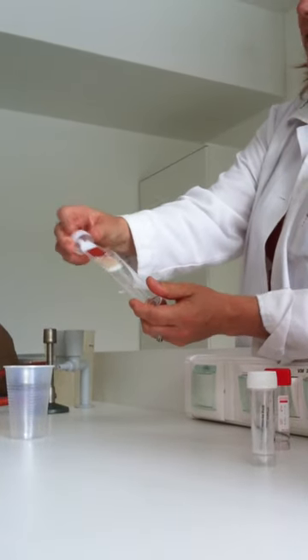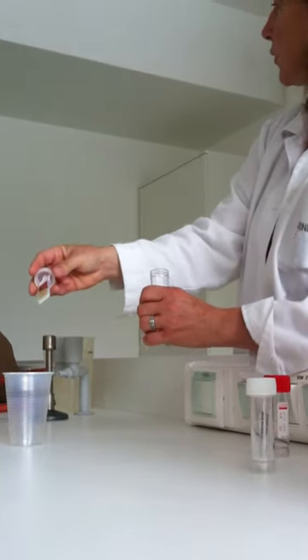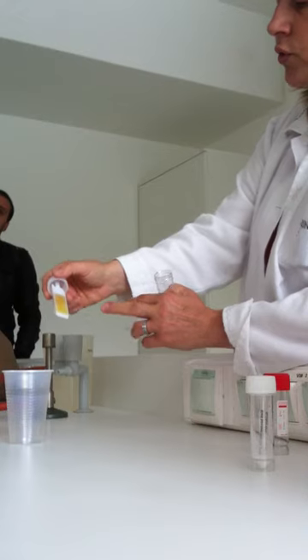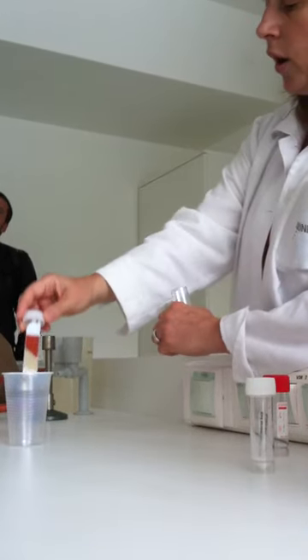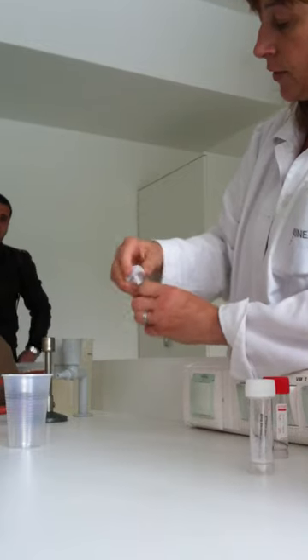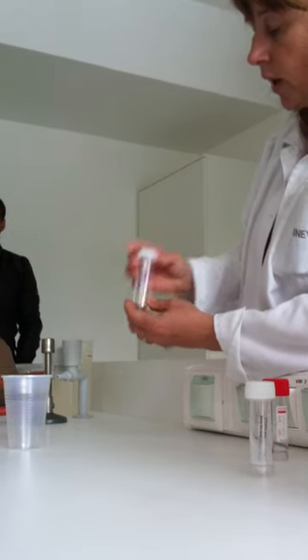Remove the dip slide from the container, then put it into the urine totally, because the most frequent mistake is that they put it in only halfway, and that's why we couldn't calculate the number. So put it into the urine for some seconds, remove it, and put it back into the container. That's it. That's the Uricult. You can see the name here.